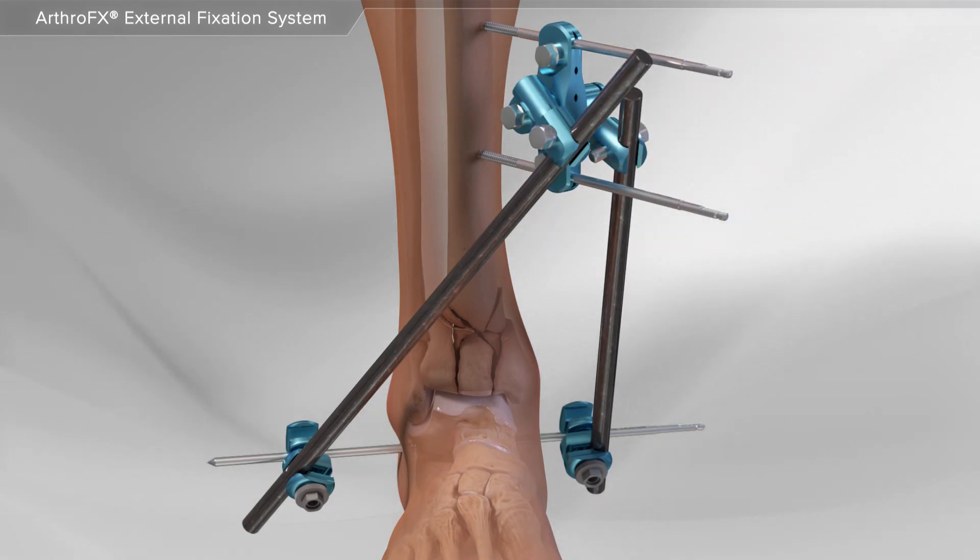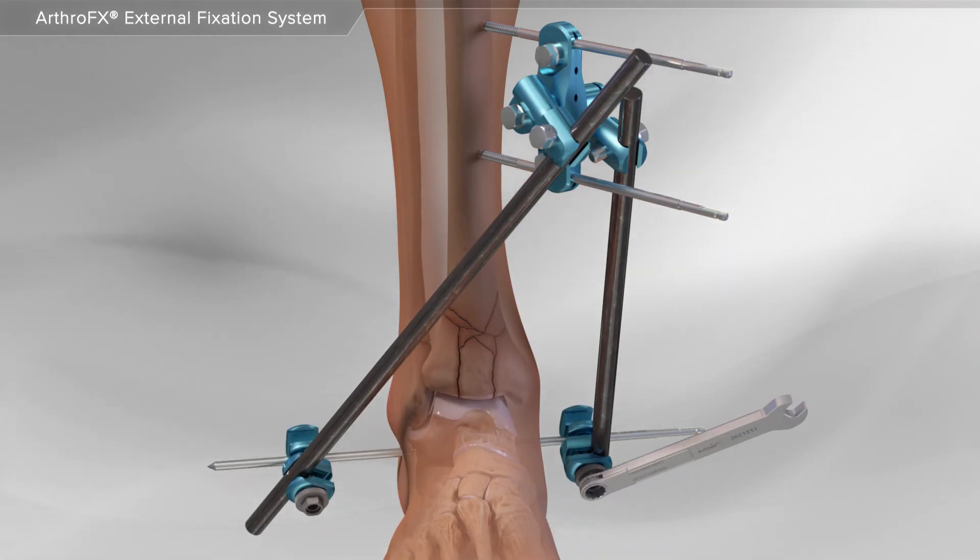The carbon rods are tightened. Lastly, your surgeon places the foot in the correct position and the final clamps are tightened.